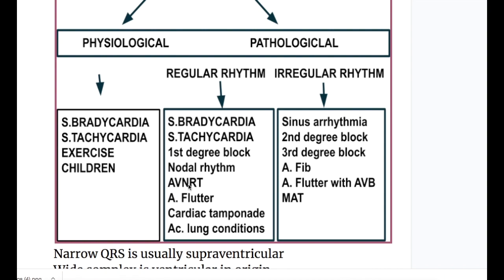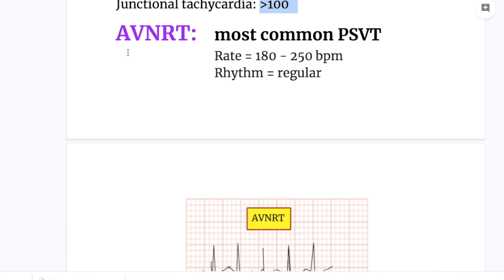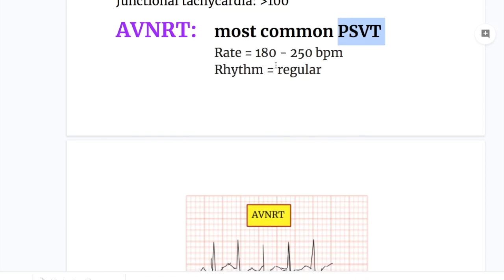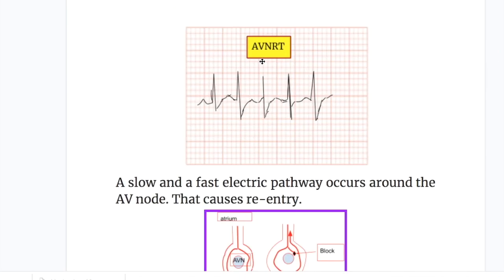Next is AVNRT — atrioventricular nodal reentrant tachycardia. AVNRT is the most common paroxysmal supraventricular tachycardia, where the rate is 180 to 250 beats per minute, the rhythm is regular, and the QRS is narrow.